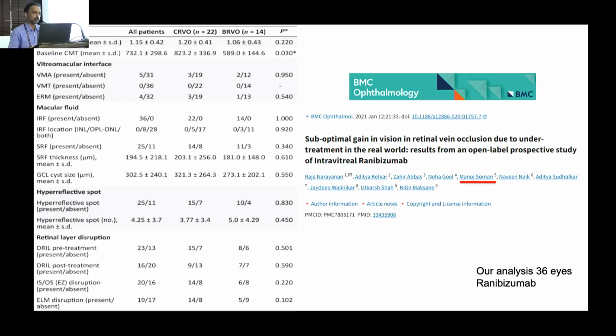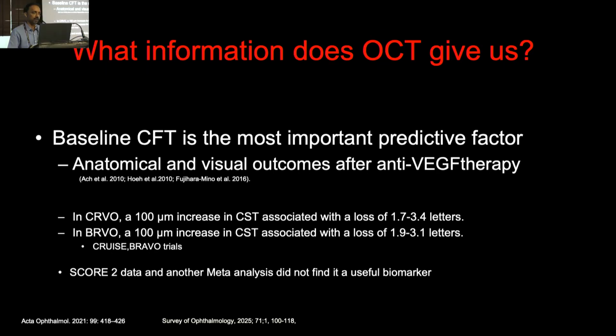Now some of the data that I'm going to present today is from a publication that we published some time ago on retinal vein occlusion. So baseline CFTs.